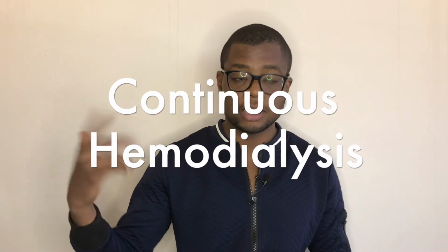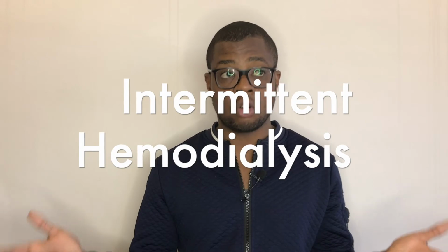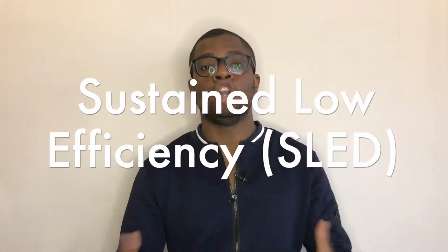When you are doing it continuously, especially for ICU patients, you can do continuous dialysis. Number two, it can be by intermittent means, which is perhaps the most common one. You can do it 3 times a week depending on whatever the patient needs. And finally, there's what is called sustained low efficiency.